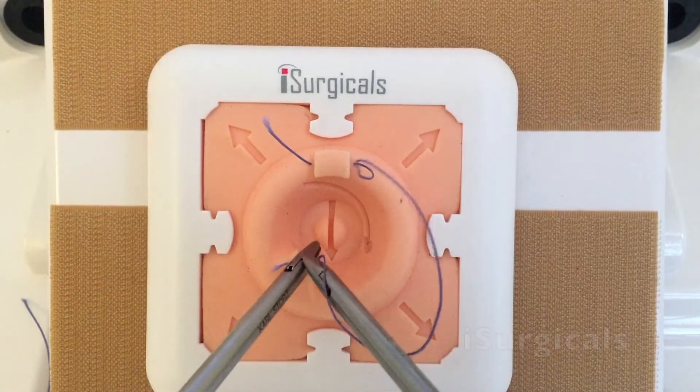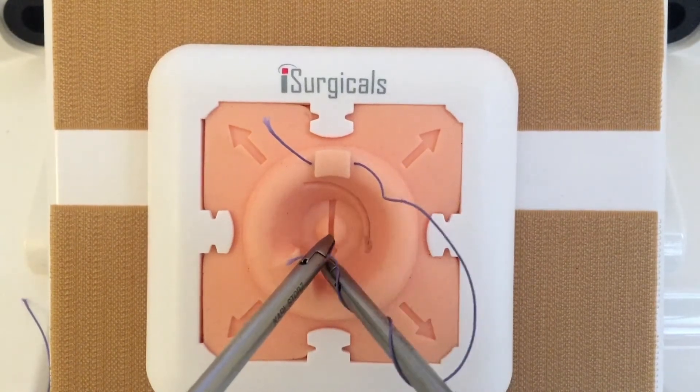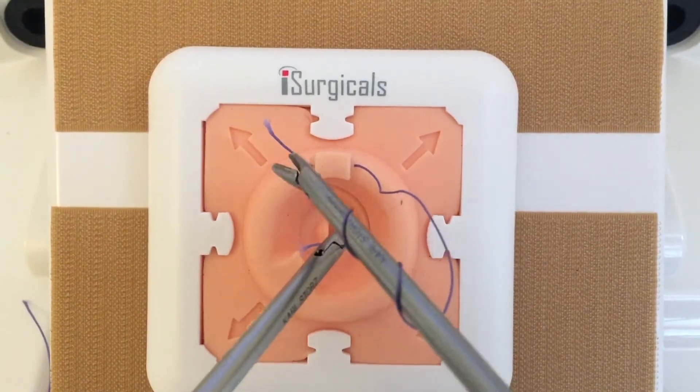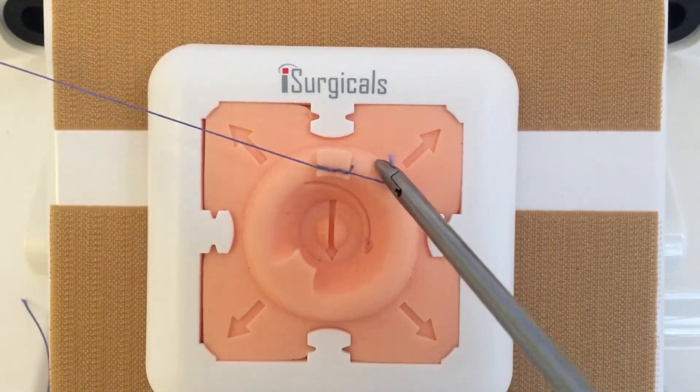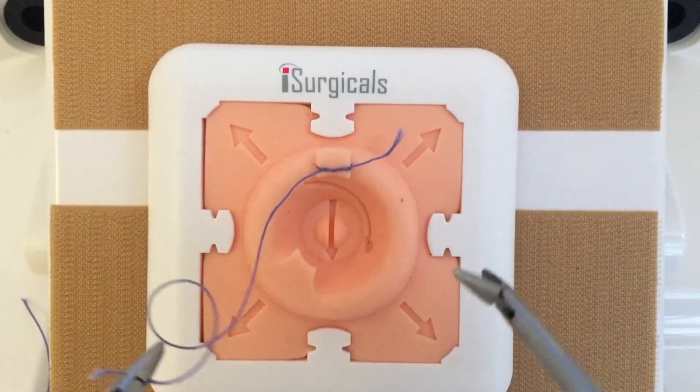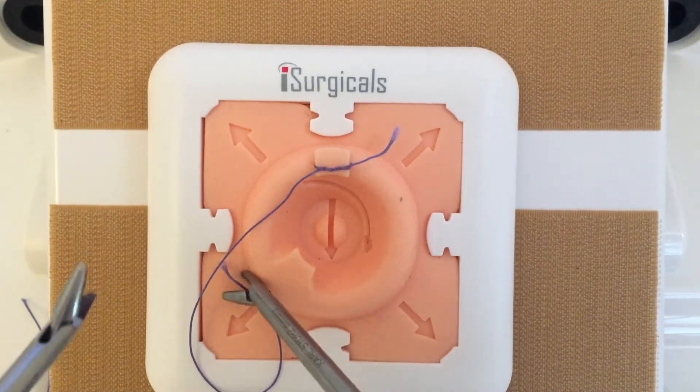iSurgicals is proud to introduce Laparoscopic Knot Mentor, a learning tool which facilitates understanding of instrument positions and direction of suture pole. This encourages economy of movement, significantly improves the efficiency of knot tying, and reduces the learning curve.